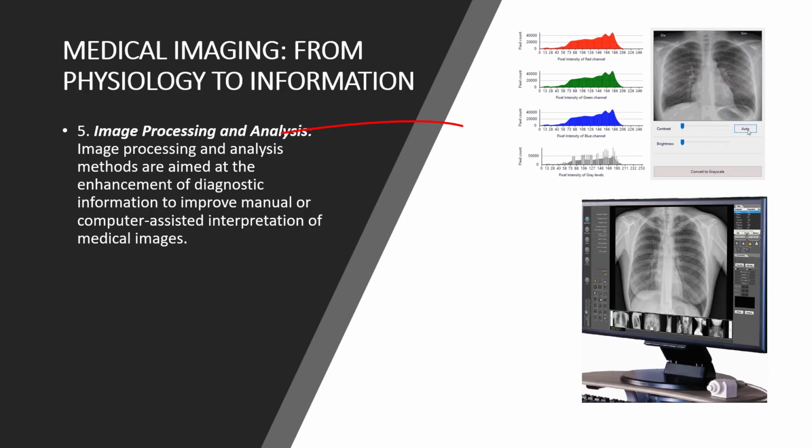Here the graphic shows the input for data on a color monitor. Notice red, blue, and green are the primary visible light colors used on a color monitor. Combinations of these make all colors that there exist.